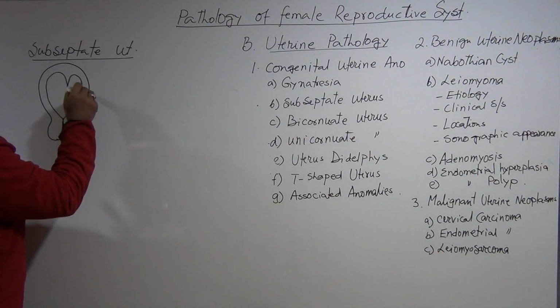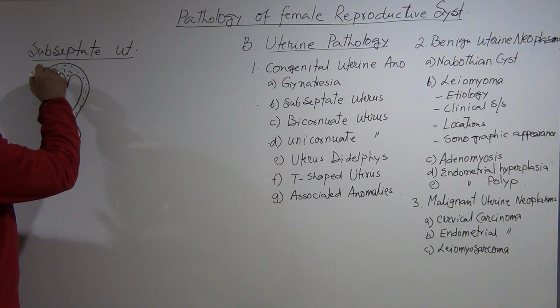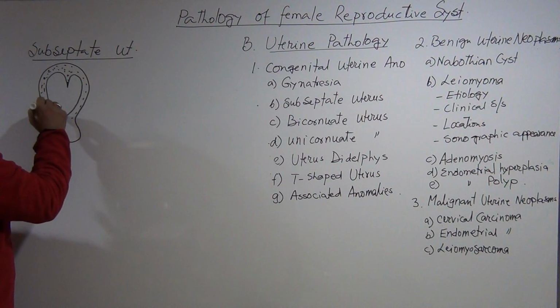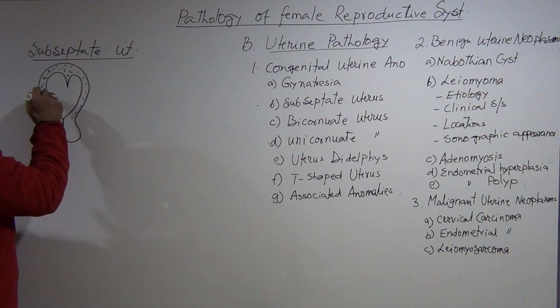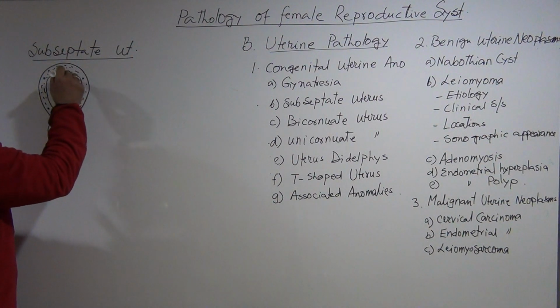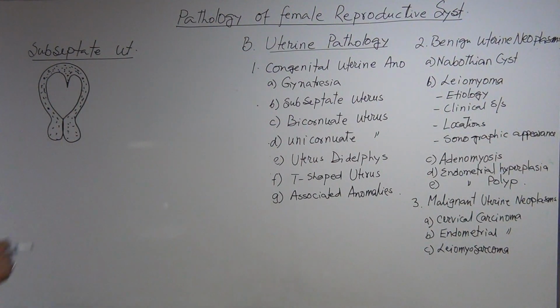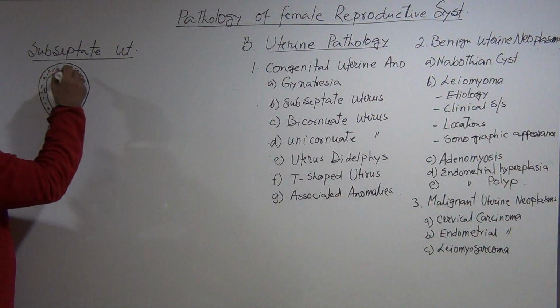Look at the inside of the uterus, the myometrium.